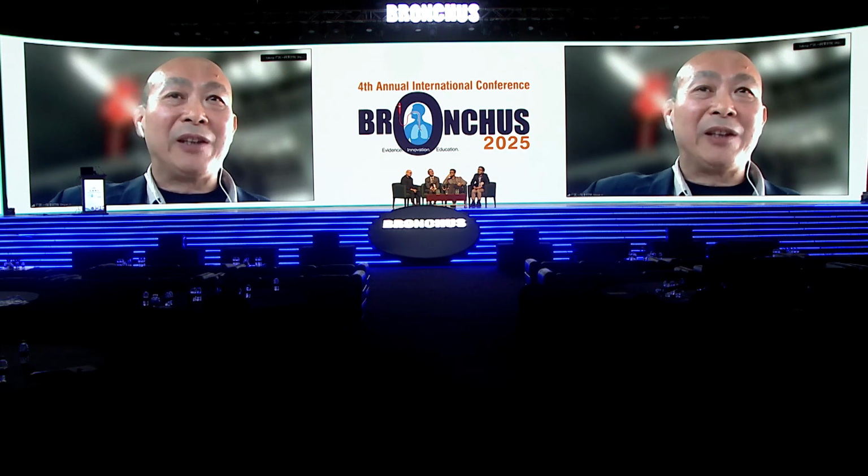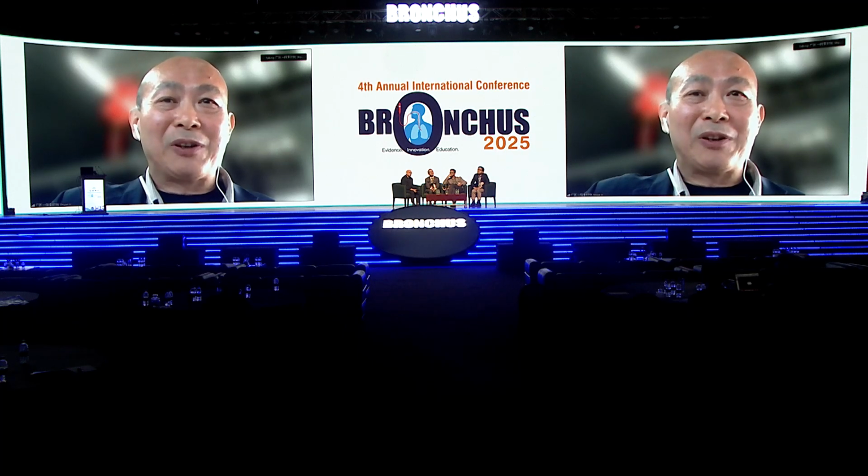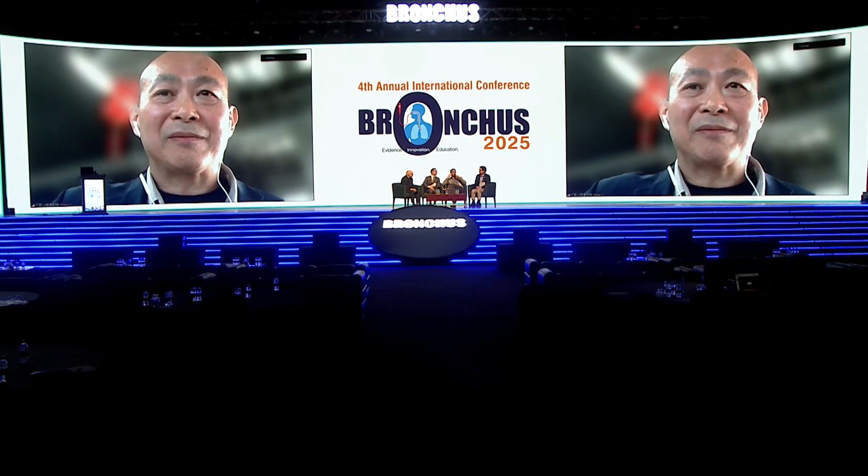Yes, so far, thanks, Felix. So far in our hospital, we did almost 100 cases with the robotic system. And for diagnosis, we routinely use the ultrasound to make sure of the position. But for the treatment, for the ablation, we combine with cone beam CT. But for the diagnosis, we just use the ultrasound, the EBUS GS.